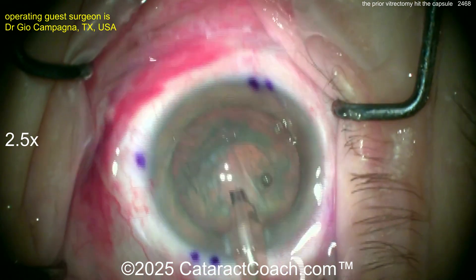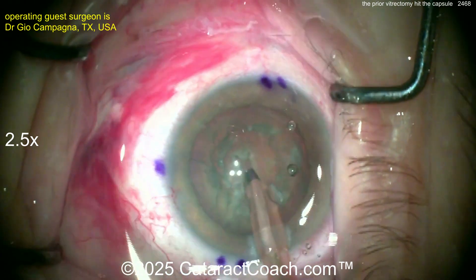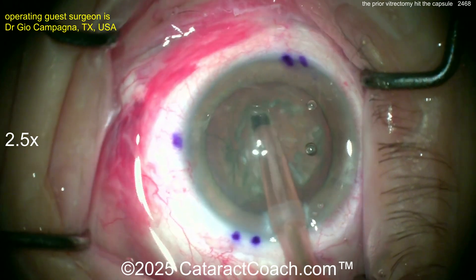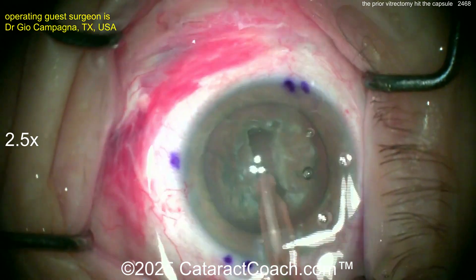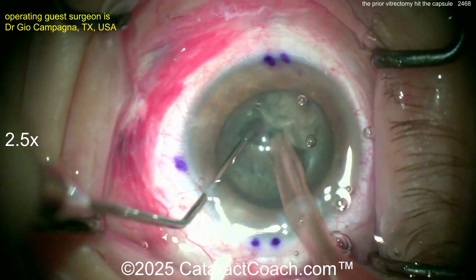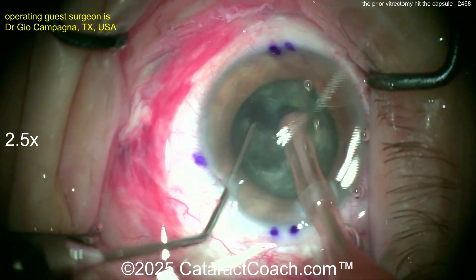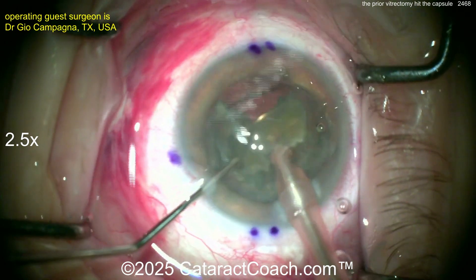Let's watch the FACO technique here — we have obviously sped up the video. Groove down the middle here a little bit. That looks good. And then another groove. This may be a good idea to do some grooving and then maybe just create two large halves, bring each half up. I'd be very cautious about operating too much in that capsule bag. You know the posterior capsule is weakened. There's the split of the nucleus — hopefully the capsule didn't split also. Chop. Bring those pieces up. Get them out of the bag. It's not that dense of a cataract.